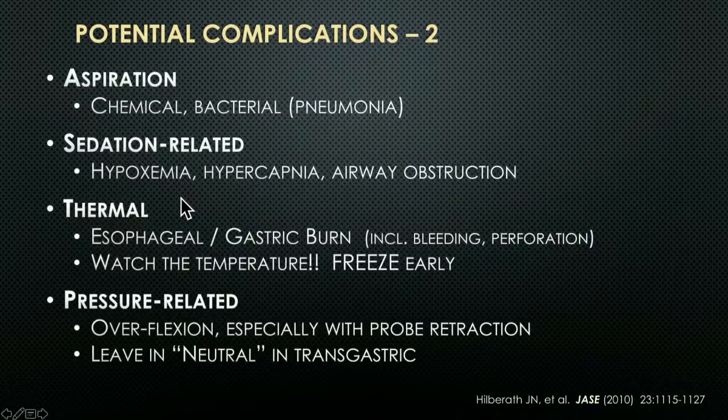We have to be aware of the potential for thermal injury as well as electrical injury, which sort of falls into this category. Allowing the probe to heat up too high. Usually the probes will self-stop imaging, but sometimes if it's sort of teetering at the brink of a high temperature, and you're imaging for a long period of time, you can cause esophageal and gastric burns, which may result in bleeding and perforation. So you should always watch the temperature of your probe and freeze early. Freezing the image stops the imaging and allows the temperature to decrease.